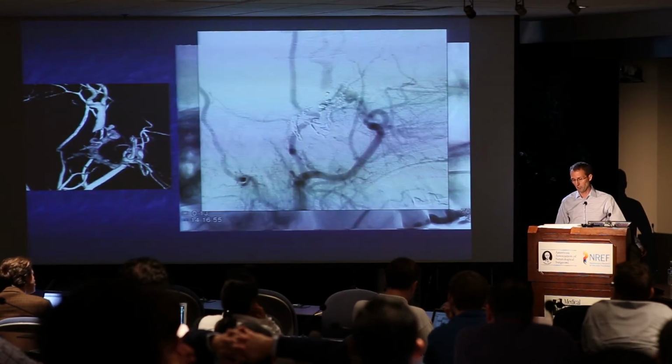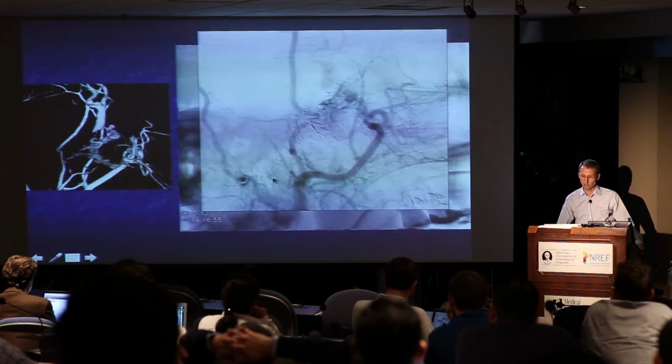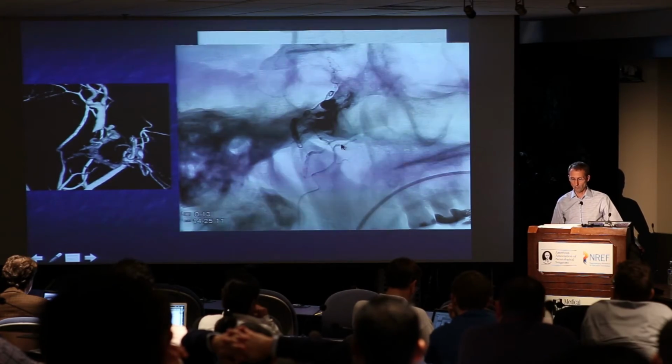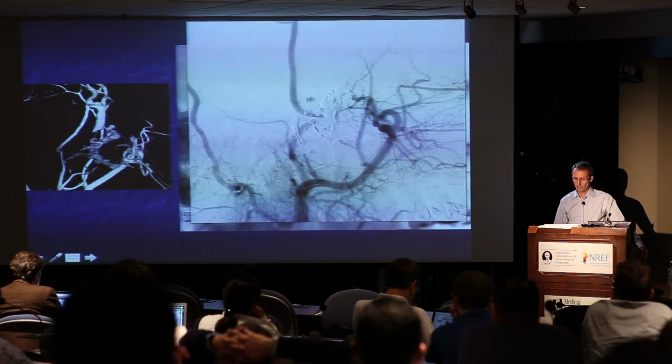We do a surveillance angiogram. And again, you can see that the cortical venous drainage is still present, so the fistula is still filling. It allows us to continue on. We didn't see any worrisome reflux or onyx going where we didn't want. And then with the follow-up angiogram, this appears to be now completely obliterated.